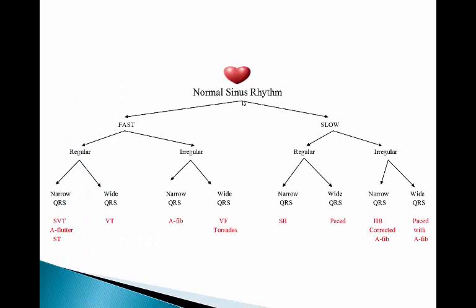There's my little algorithm again. So again, if you want to think about this from a perspective of, is it too fast or too slow, regular or irregular, then that gives you an idea about what it may be.